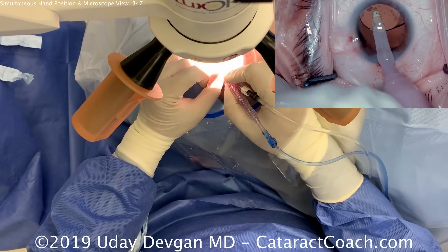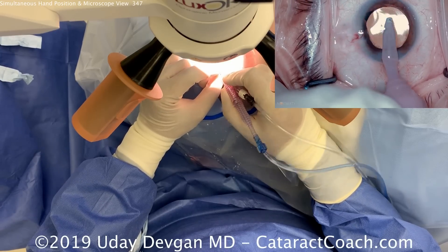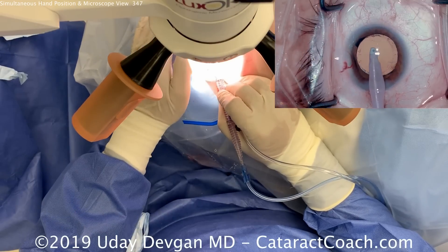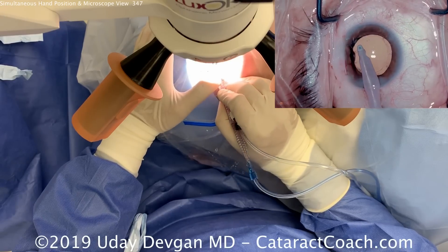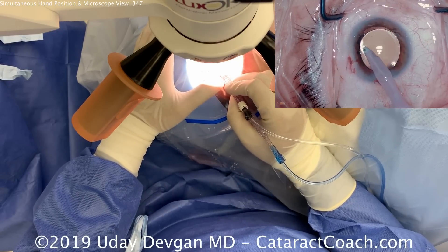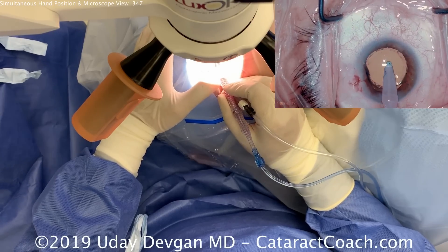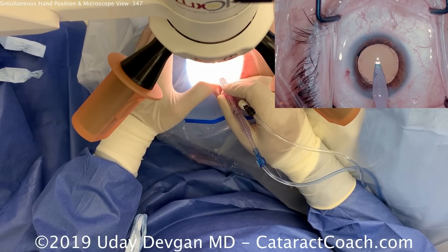Look at the amount of pivoting with the right hand during viscoelastic removal — the left hand is just there for support. The left hand is now holding the patient's head so the patient doesn't move, while the right hand pivots within the eye to remove viscoelastic. This gives us a minimal amount of movement.